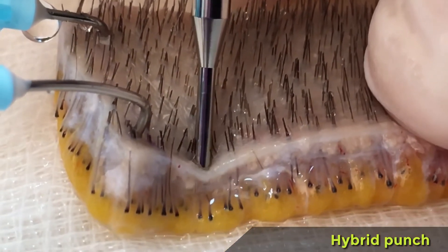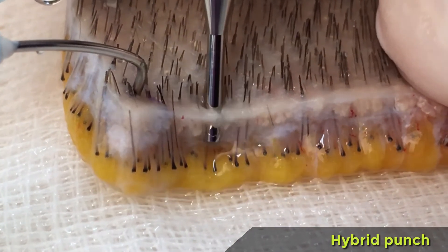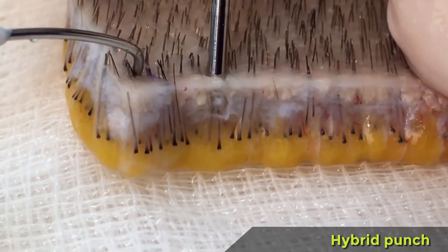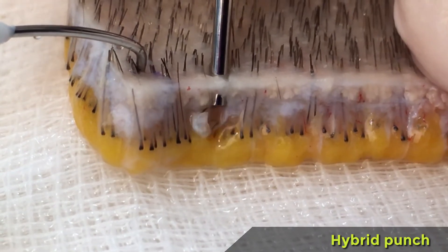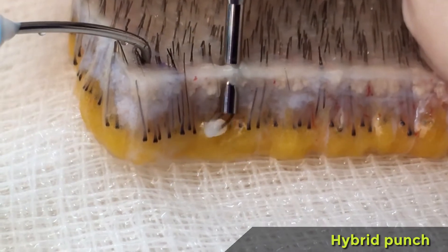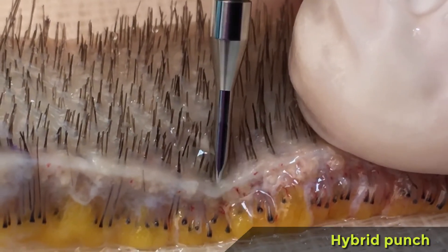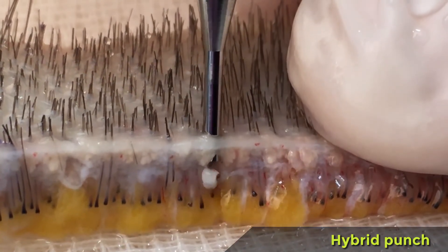A last sequence shows the phenomenon of buried grafts — so frequent with robots, but only occasional with the hybrid trumpet punch. A deep penetration combined with a high rotation speed and a wide oscillation results in the torsion of the follicular unit, which, as it is still tied to the subcutaneous vessels, undergoes a violent traction downwards and gets definitively buried.